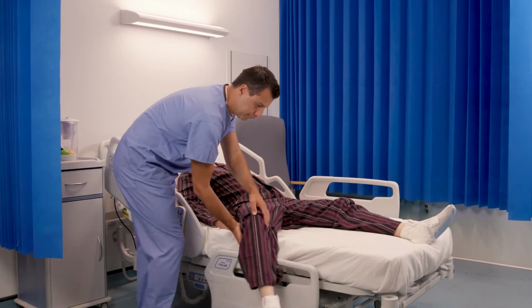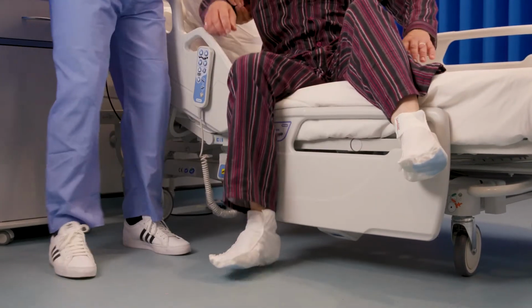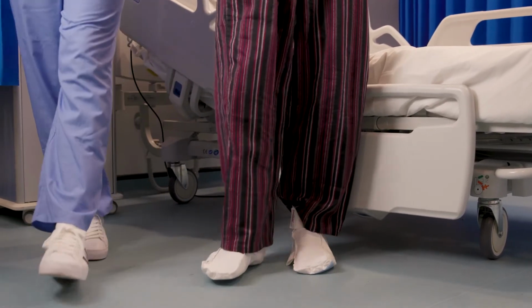They have a non-slip sole. This is important because patients would generally be in bed when they're at high risk of getting a pressure ulcer on their heels, but may wish to get out of bed and move to a chair, and that's to ensure there is no risk of slips and falls.